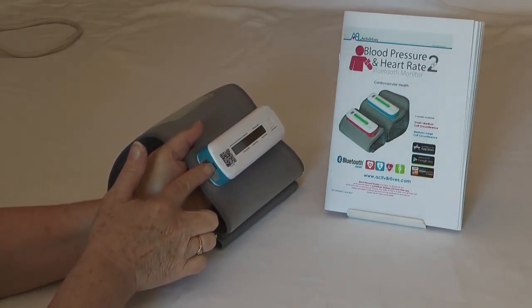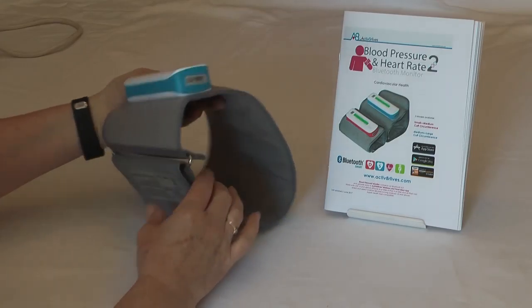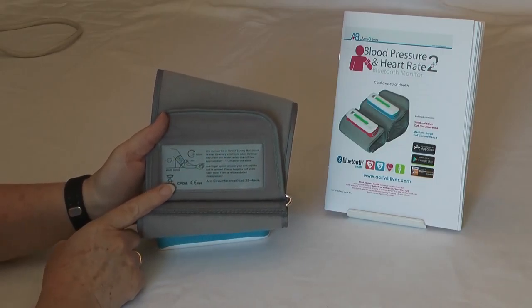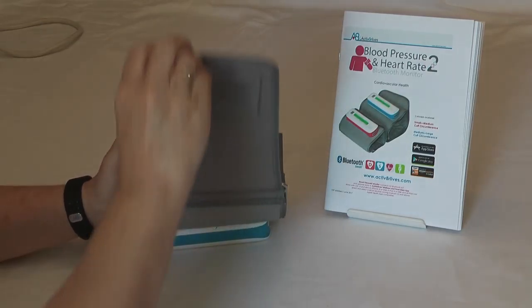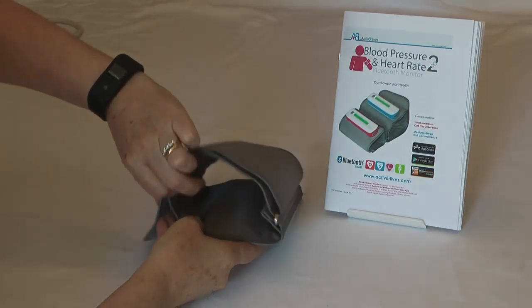This is where you put the charging USB cable in, and that is the serial number of the blood pressure monitor. It also has a label with instructions for fitting. To adjust it so it's a firm fit, slip the cuff through the D-ring and secure it firmly.